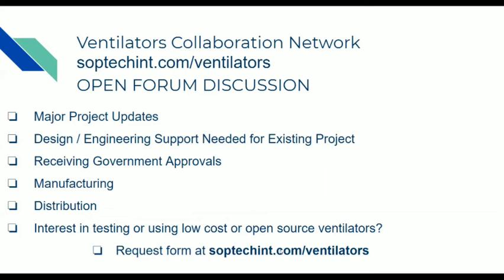I'm going to do a shout out, and it's interesting that they're using wiper motors. If you guys have a supply chain system already in place, it would be interesting to see what kind of availability you could get on wiper motors, because it does seem to be the default choice for motors for the better designs. Okay, that's all I'll say.